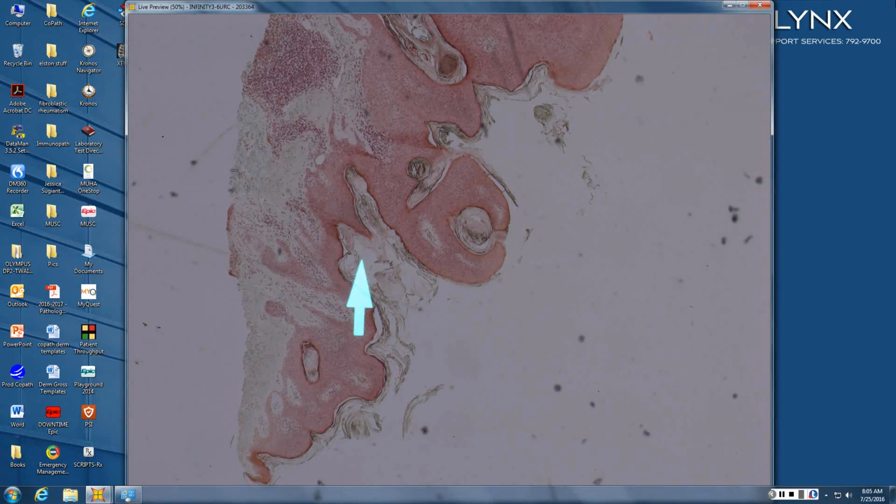Looks awfully seb-like. So what makes it awfully seb-like? Well, it has some... Could you elaborate, sir? Sure, the trees are kind of reticulated, and I see some, I guess, horn cysts in the epidermis there. So it's an acanthoma with lamellar keratin cysts and pseudocysts.